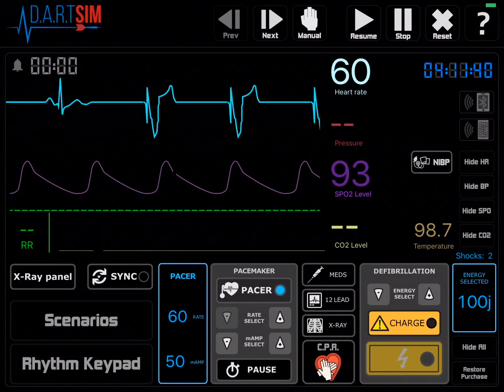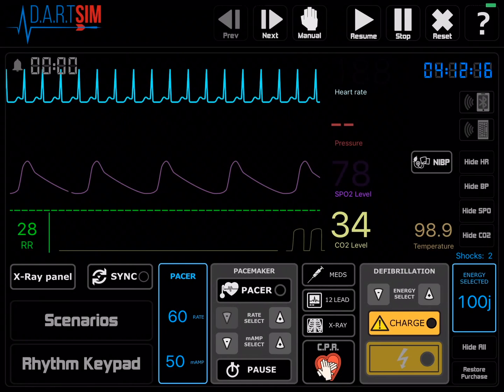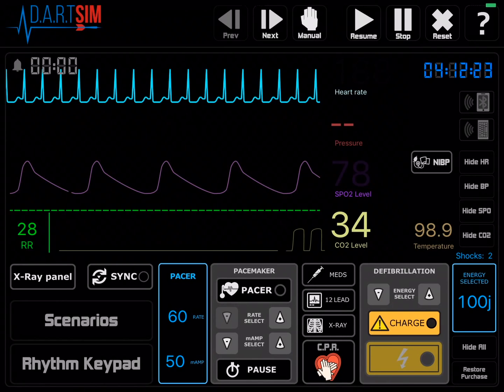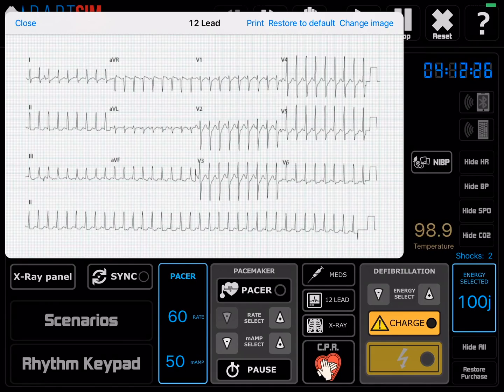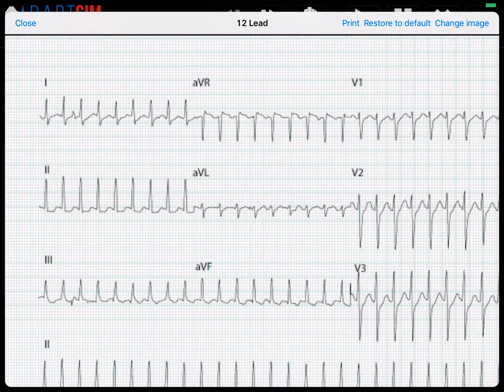There are a couple other things you can interact with on the monitor. For some of our scenarios, it's very important that you do a 12-lead. If you look just below the ETCO2 level, there's a 12-lead button. Go ahead and hit that and it'll bring up your 12-lead, and you can even zoom in on particular leads.